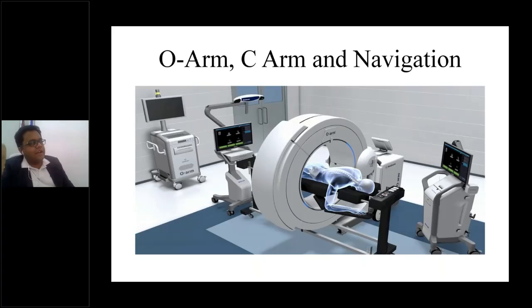See, this is not validated, and if you do not report this and the patient gets operated at the wrong level by the artificial intelligence of this machine, then there are n number of patients who will be operated in a similar manner. So if you come up with such problems, it has to be reported as soon as possible to the concerned agencies, and the developer needs to be penalized or told that the rectification needs to be done.